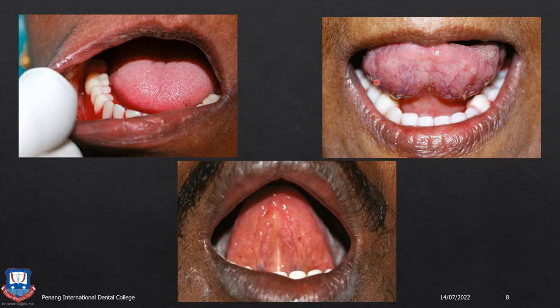Like here, you can see the teeth are arranged in such a way that the tongue is large and there is not enough room for the tongue to lie within the mandibular teeth arrangement. This will create instability. Then you also have to check the alveololingual sulcus, to see that the denture extensions do not cause dislodgement or displacement of the denture.